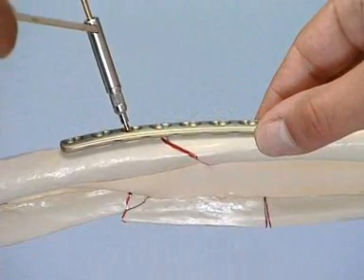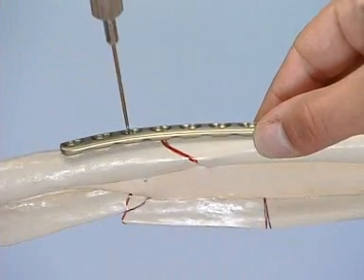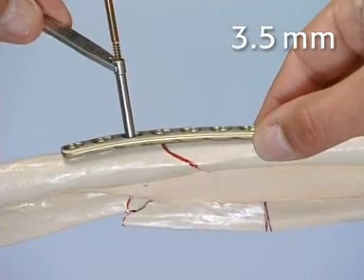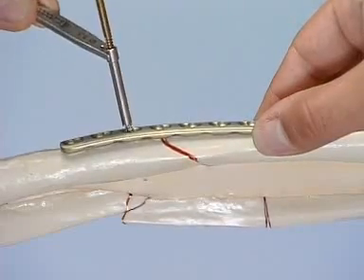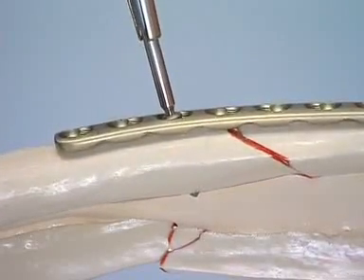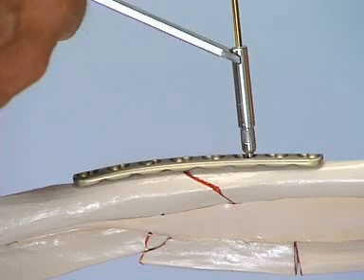The first screw hole is proximal to the fracture and close to the obtuse angle. It is drilled neutrally with the 2.5-millimeter drill bit through the universal drill guide. The screw length is measured with the depth gauge, and the thread is cut with the 3.5-millimeter tap. The plate is fixed with the first 3.5-millimeter cortex screw. In the distal fragment, a second hole is drilled close to the fracture using the universal drill guide in compression mode to place the screw eccentrically into the plate hole.